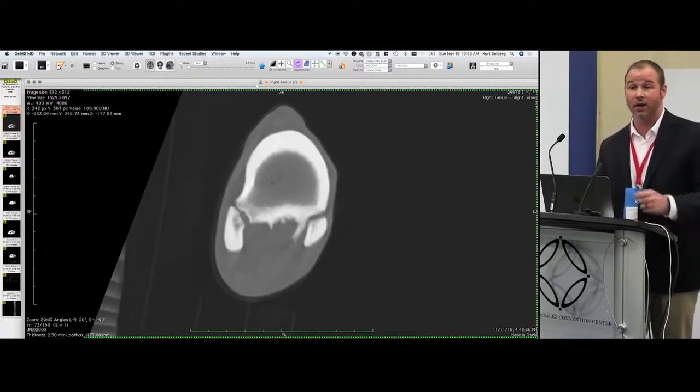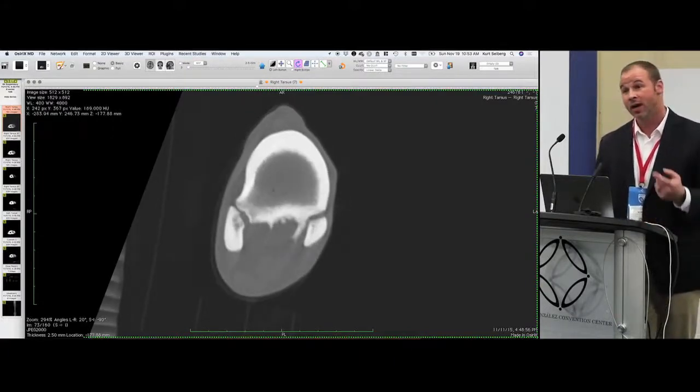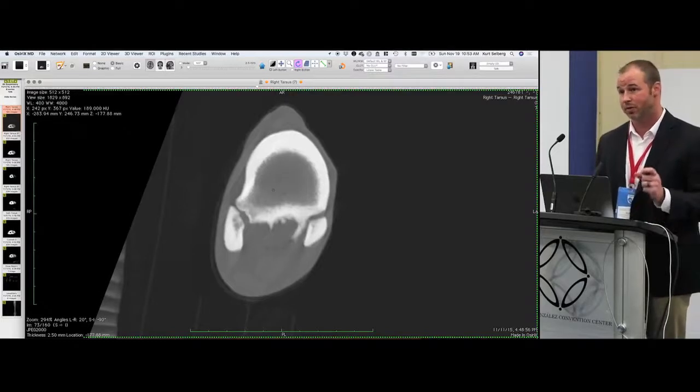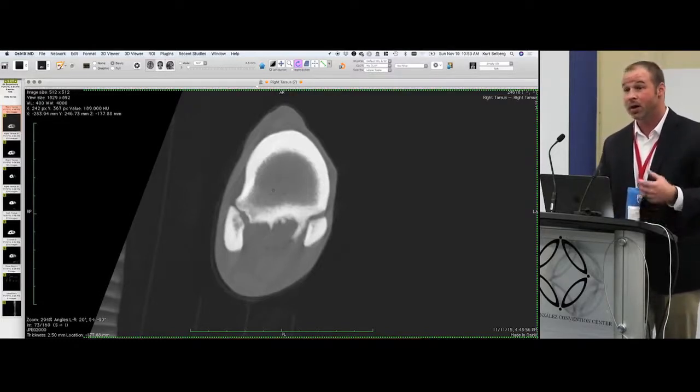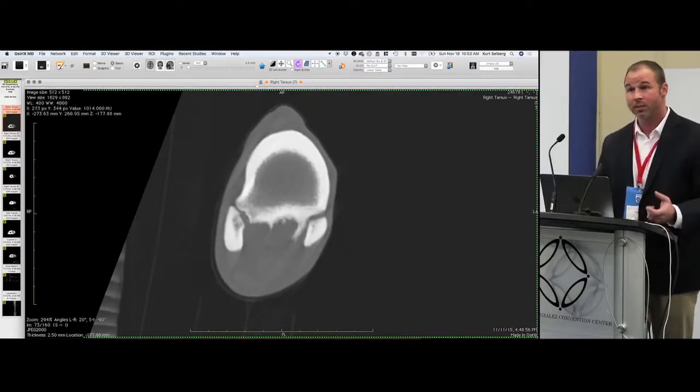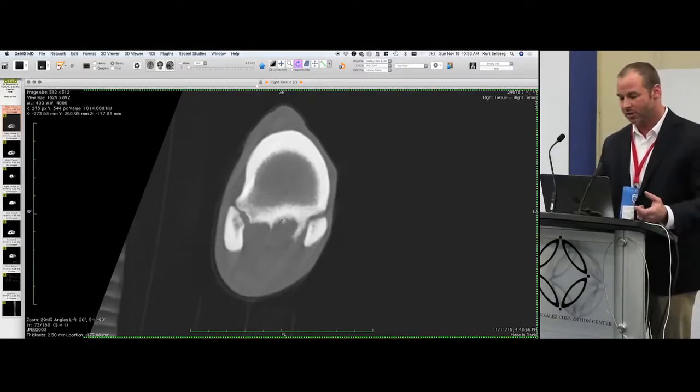The one thing we're not going to see on CT is bone fluid, and that's a disadvantage a little bit in terms of figuring out some of the diagnosis. Some of these horses will have their major component of their diagnosis be bone fluid within the proximal aspect of the third metatarsus bone, but we're going to get a reasonable identification of some of the soft tissues.